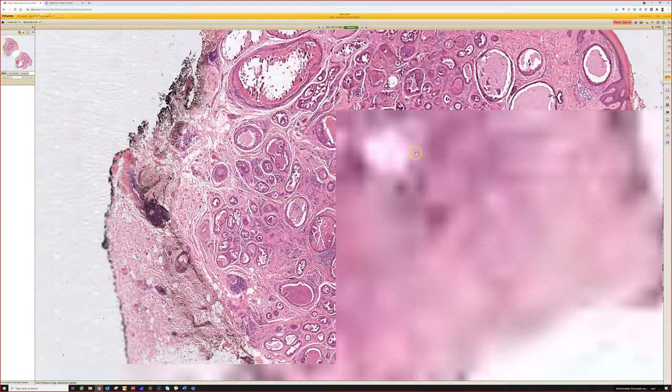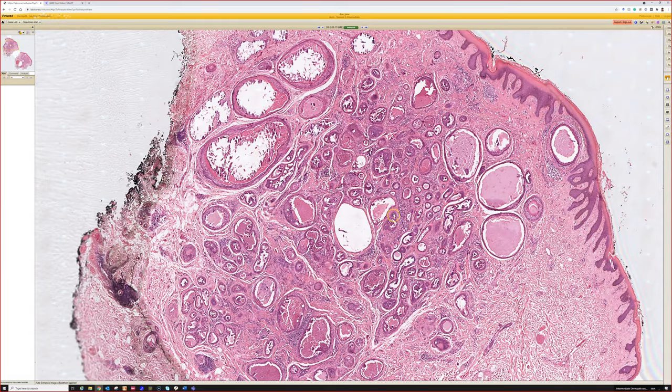So the important thing to note about this is most of the sweat gland tumors we've looked at today are nodules that are sharply circumscribed, right? This is a tumor, though, that especially if you get a biopsy in the middle, it has multiple tubules centered in, or sitting in the dermis apart from each other. Because of that, it can give the impression of an infiltrative growth pattern, which is a feature in sweat gland tumors. We worry if we see infiltrative growth or if we see obvious cytologic malignancy.